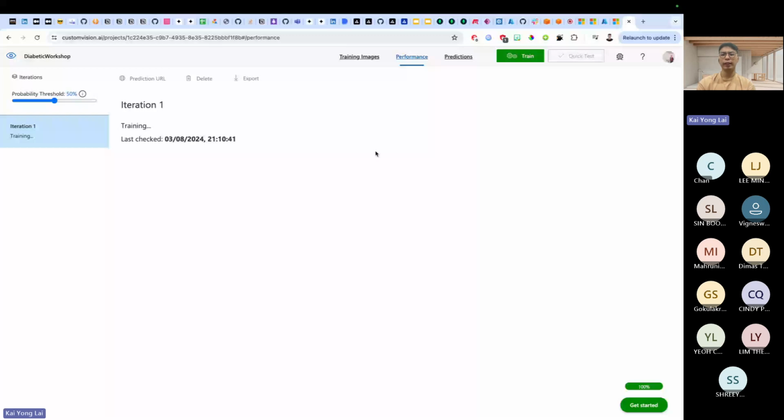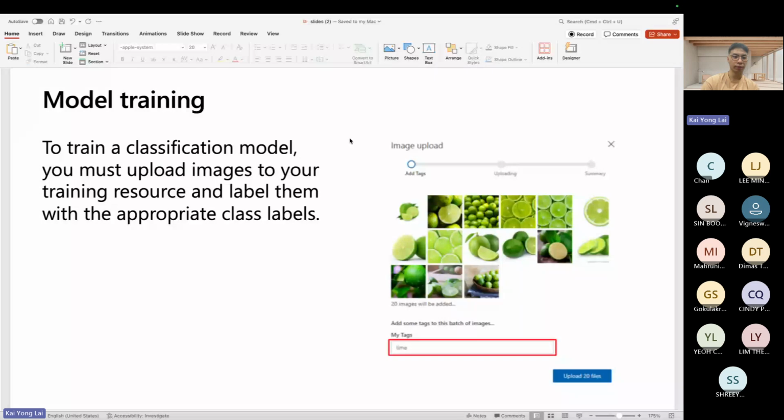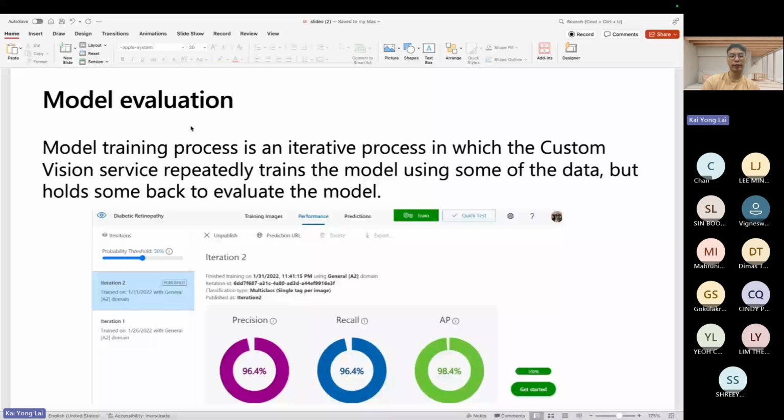So training might take longer than how we upload the images. Of course, you can fine tune on the probability threshold if you wanted. And later it will have a glimpse of how the algorithms work as well. We should look into it. Okay, so now we have done the image uploads. And then this is what we'll look at later, the model evaluation. So this is the context of how it looks once you train your models.